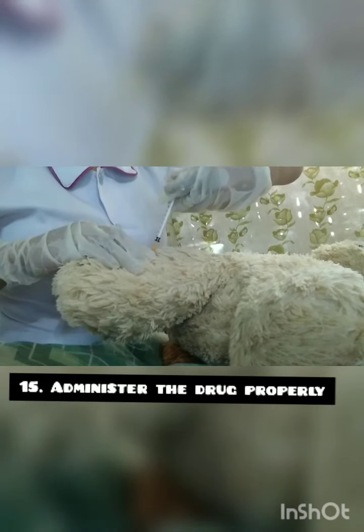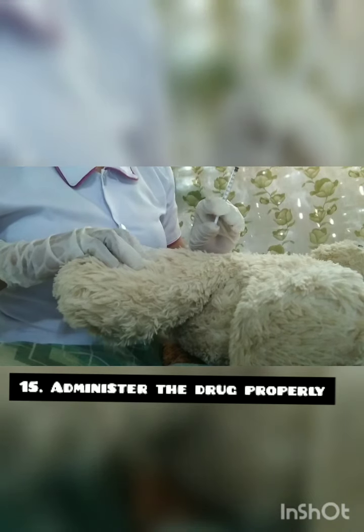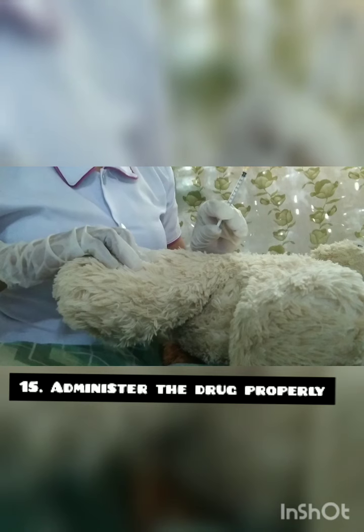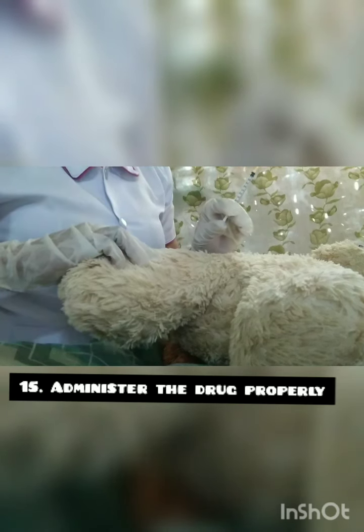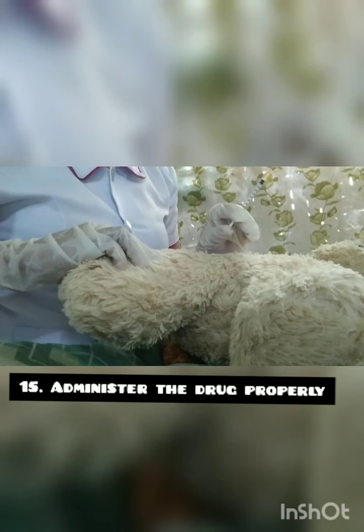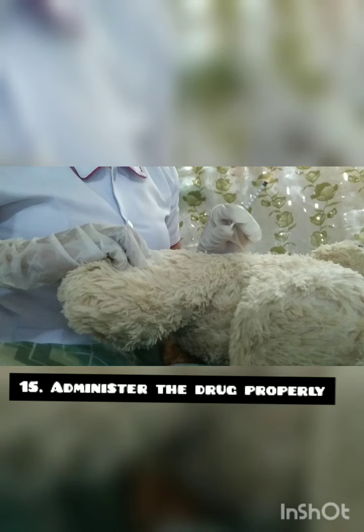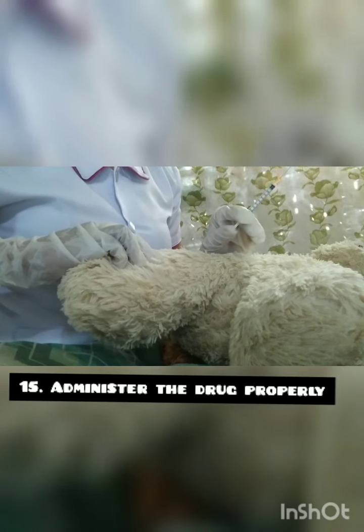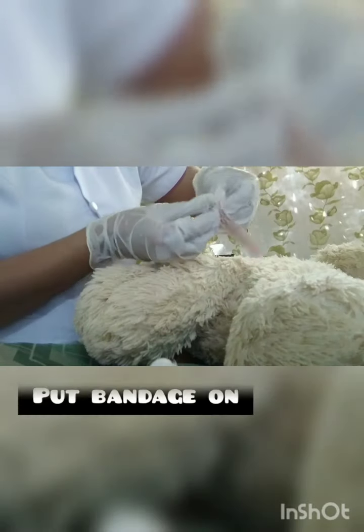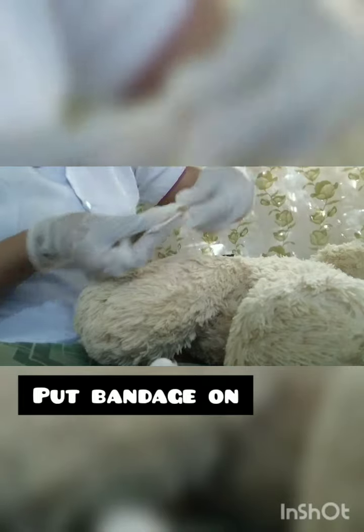Apply gentle pressure to the site. Do not massage the site since it damages underlying tissues. It ensures that the medication reaches the muscle mass. Apply bandage on the site.